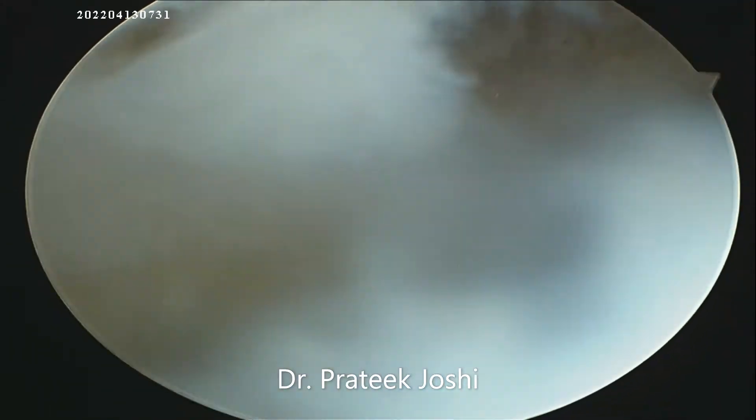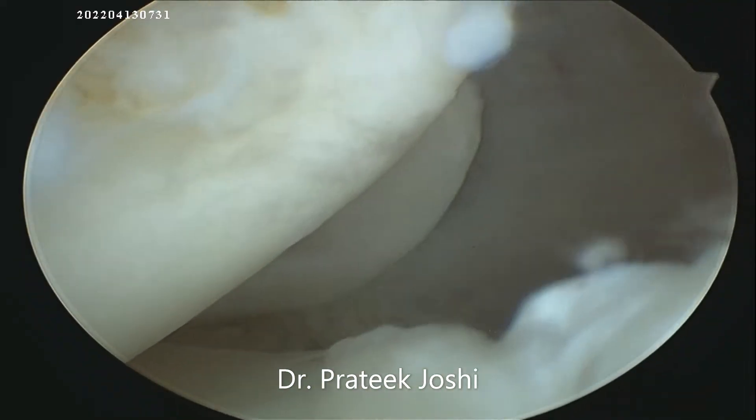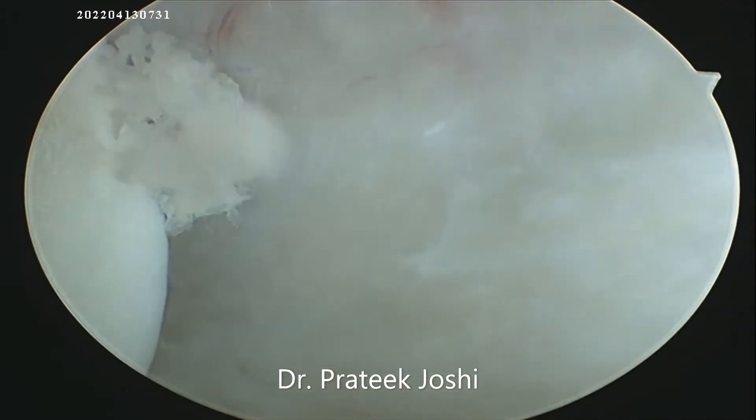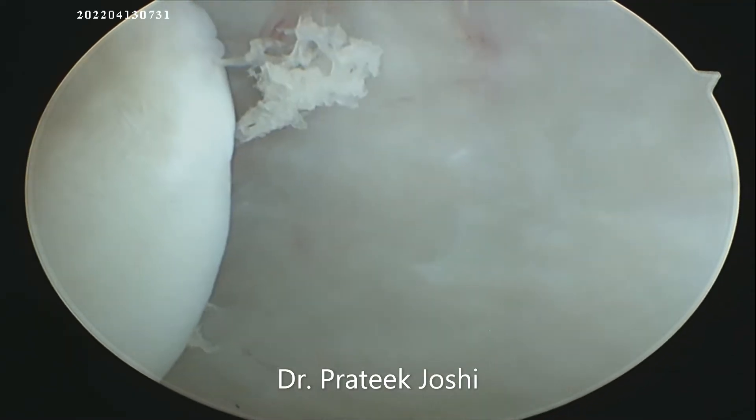As you can see, the torn portion of the meniscus is lying in the posterolateral corner. We are now going to create a posterolateral portal by outside-in technique and we are going to retrieve the torn meniscus piece.